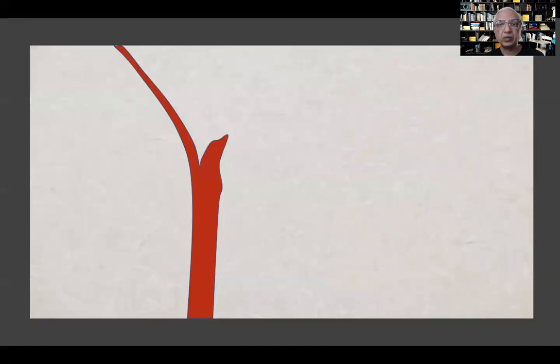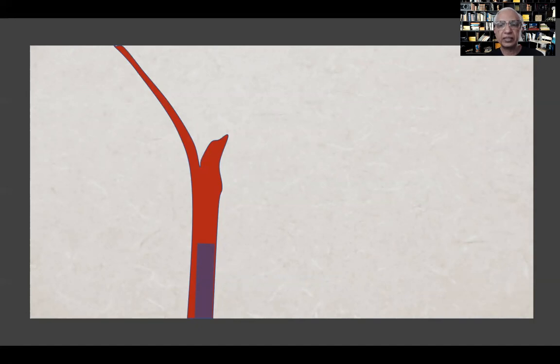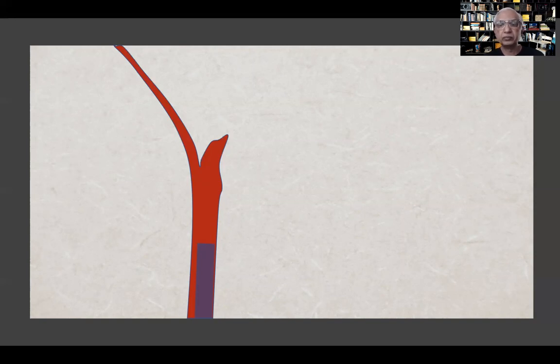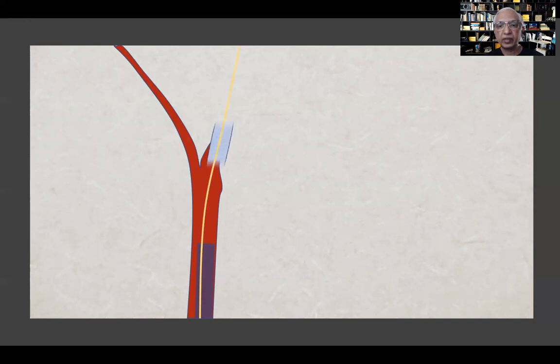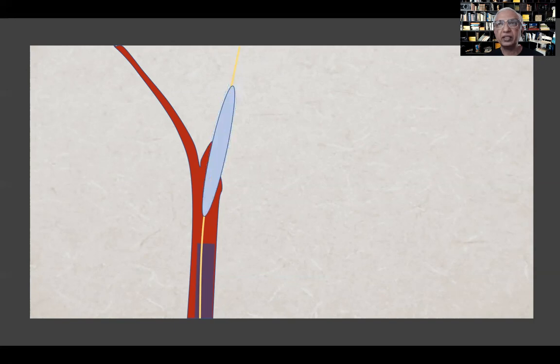When a patient comes with an ICA occlusion and the picture makes it difficult to know the underlying cause, our approach is to use a long sheath — the Neuromax, Infinity, or similar — is fine as long as you decide the approach. Take a coronary wire, cross, then pre-dilate the lesion with a long balloon if possible 20 millimeters. As you pre-dilate: if it is a thrombus nothing will happen; if it is an underlying stenosis, you create a passage to allow the long sheath to track across.